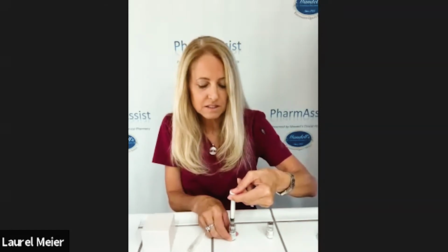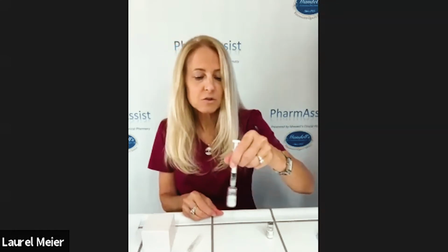Draw up 1 milliliter of the liquid. So you go a little past the 1 and you push the air out until you're right on 1. Pull off your liquid and put it to the side. Now we're going to pretend to mix the powder. So here's the first powder. You push the Q-cap on, you inject the liquid into the powder, and you swirl it very gently. This powder will instantly dissolve.